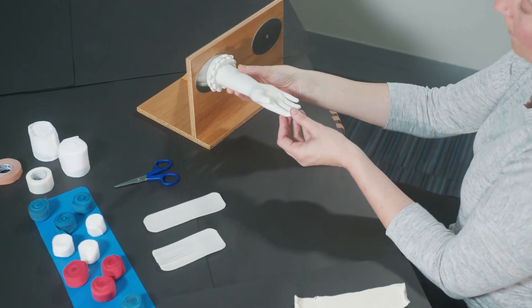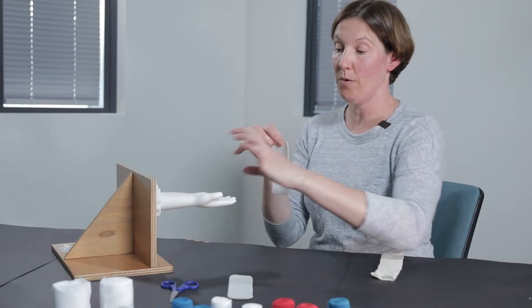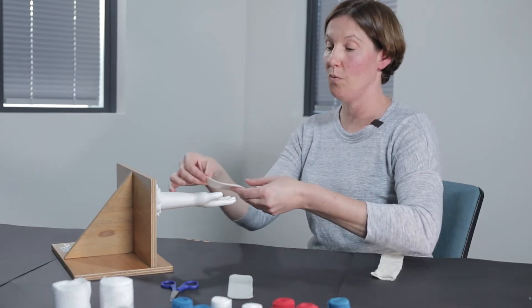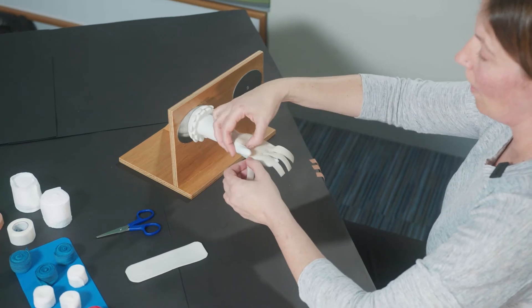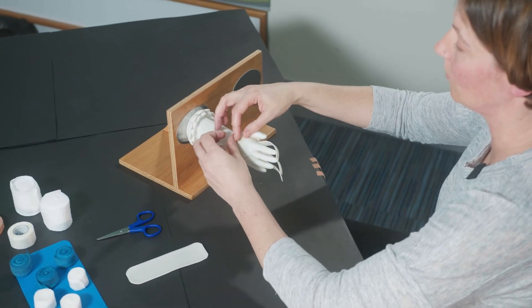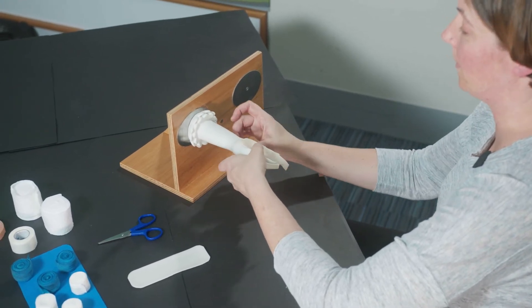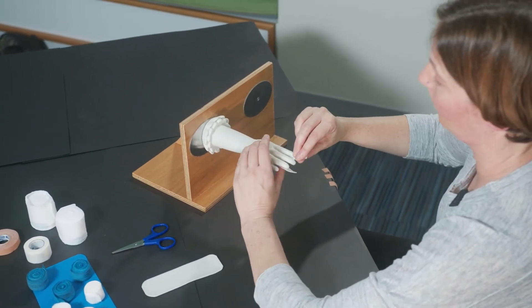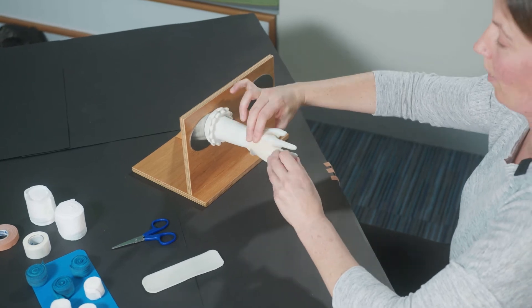Once you're done laying that contact layer, we're going to take a thin foam. This thin foam has been pre-cut — it's about the width and length of the palm, and about double the length, and we've put three slits in there to help you get this in place as quickly and easily as possible. I'm laying that in the palm and pulling it through each of the web spaces to provide that layer of foam to each of the web spaces where we've placed the mesh contact layer. I'm securing that underneath with my thumb and fingers to hold it in place on the palm as well.